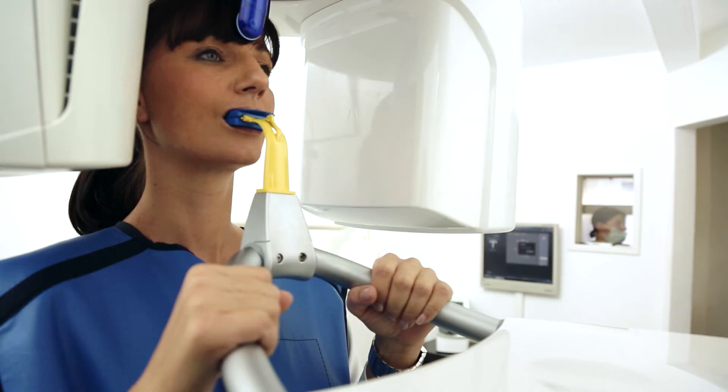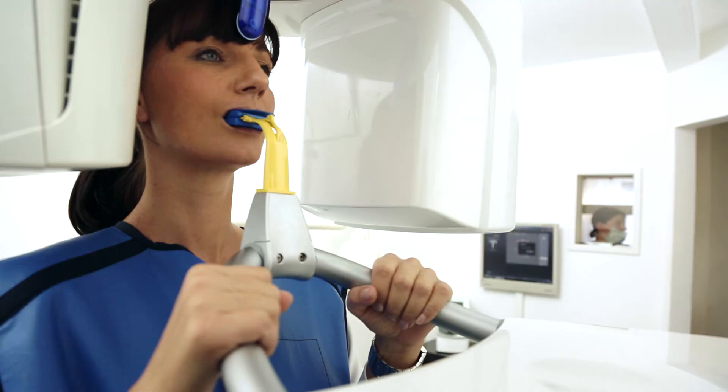Orthofis SL has made working with digital technologies in our practice even easier. We have smoother handling, and the perfect images improve the evaluation process. This makes our work even more efficient.